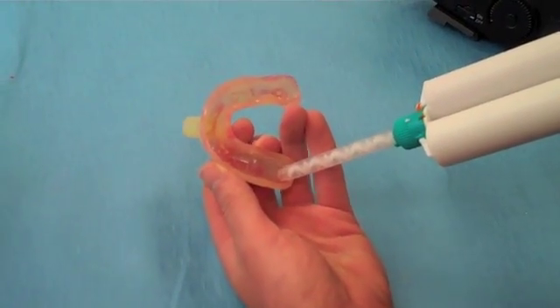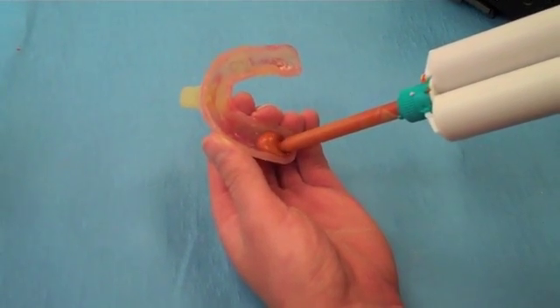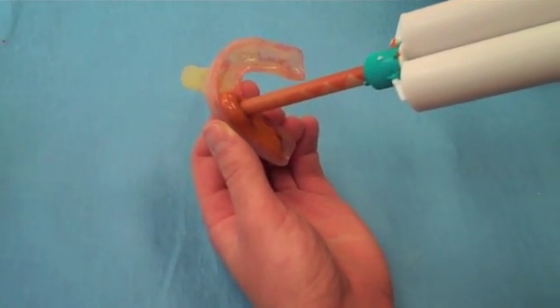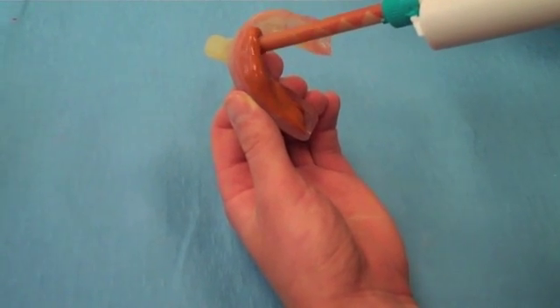Filling the impression tray takes more force than you might think. Fill the tray completely and then seat. The tray is held in place for 6 minutes or per manufacturer's directions. Remember, impressions taken outside the mouth take longer to set.